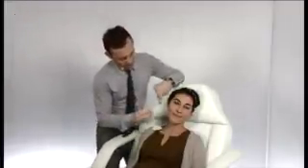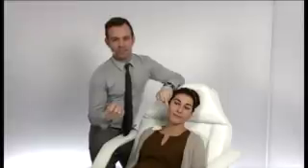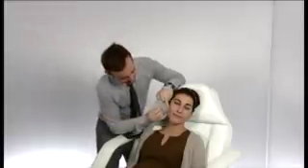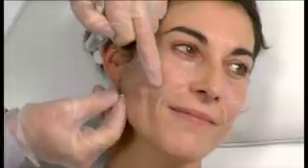You can keep on using needles. However, with a cannula, do you want happy patients? For me, I live in LA where a bruise is a cause for a fundraiser, so yes, I want to produce as little trauma as possible.